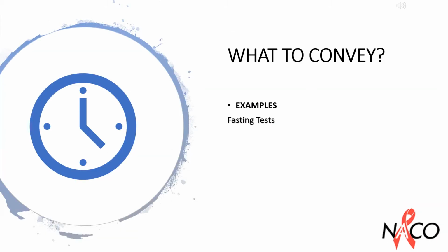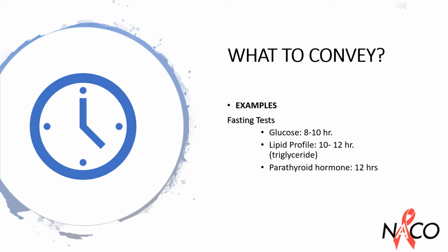It is important to inform the patient regarding tests which involve fasting. For example, for fasting plasma glucose, a fasting period of 8 to 10 hours is required. For lipid profile test, 10 to 12 hours of fasting is required. For parathyroid hormone, 12 hours fasting is required depending on the analytical requirements.